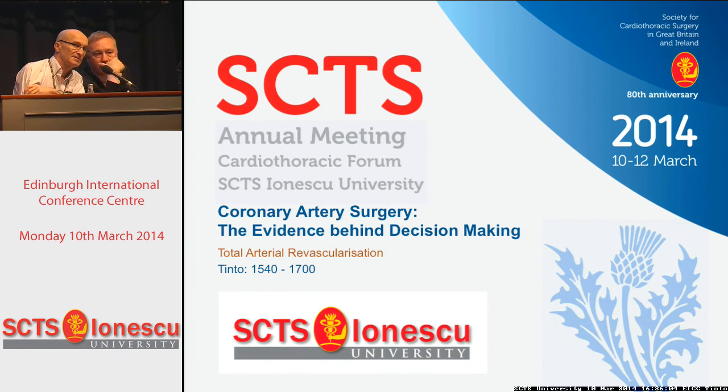From the paper that was produced from Philip Hayward's group a couple of years ago, which looked at progression of disease, moderate lesions, left versus right. Left seemed to progress quicker than right side. So nowadays we have FFR, which can tell us which vessels to graft.